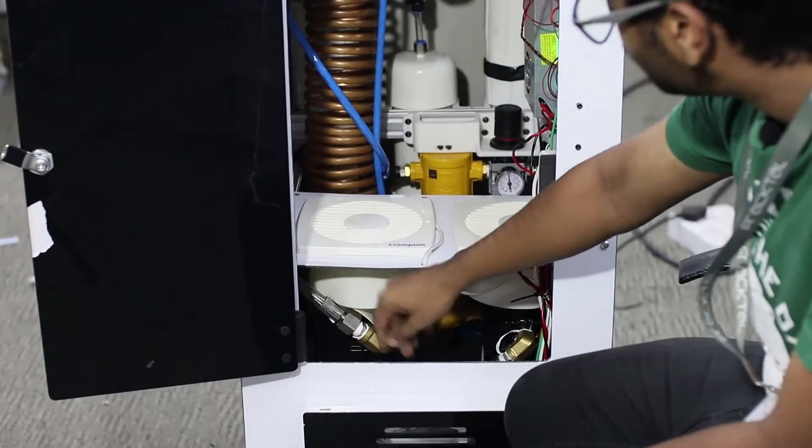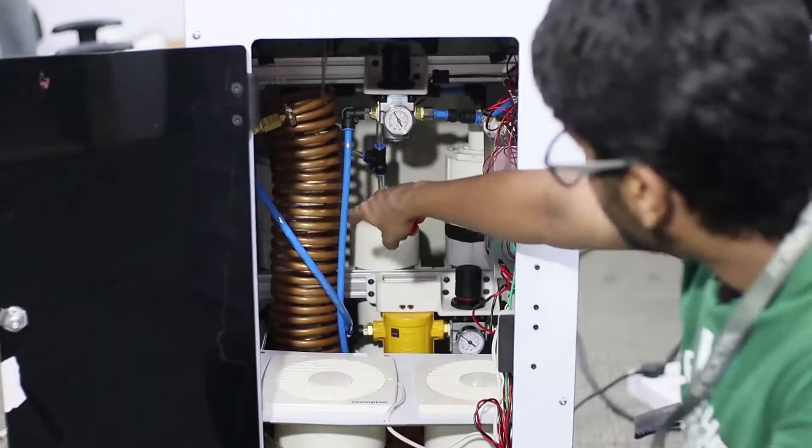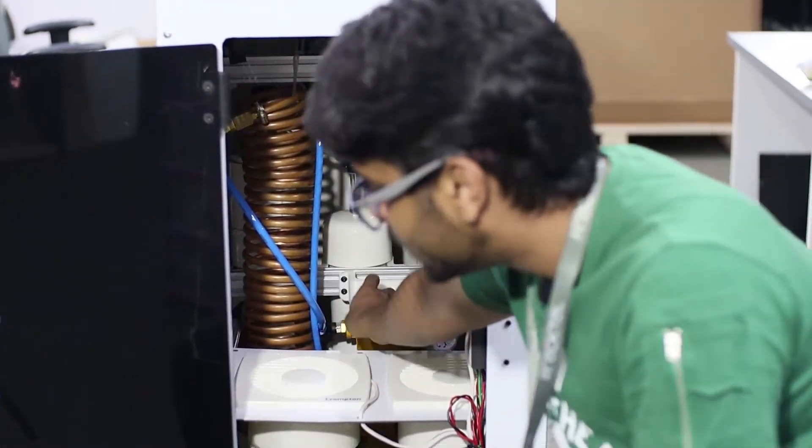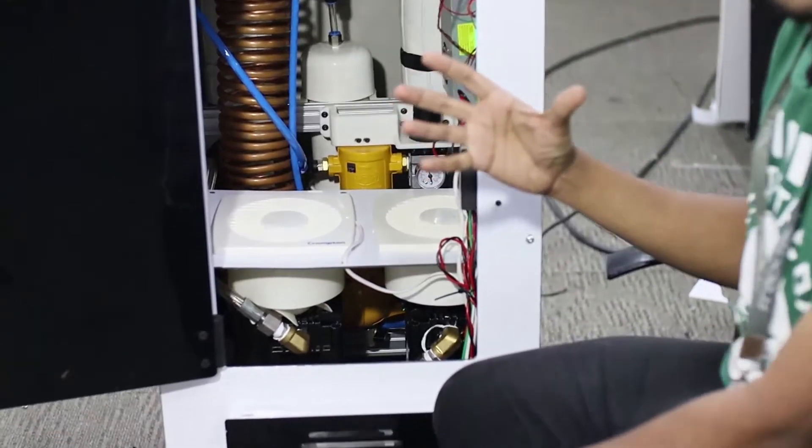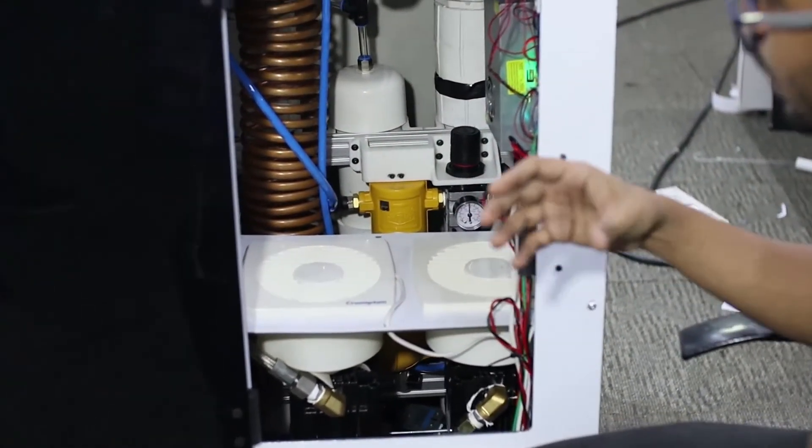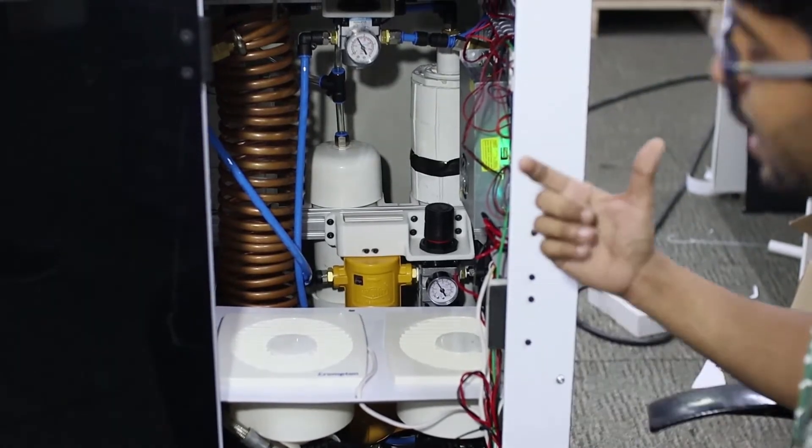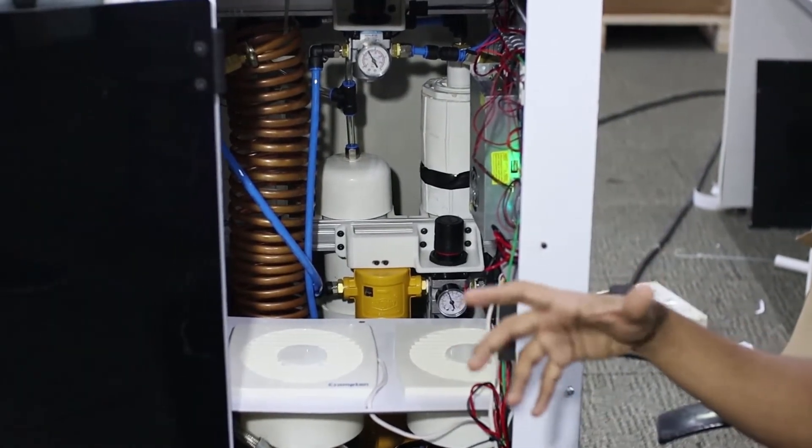The air from the compressor is cooled with the copper cooling coils over here. The cooling coils then go to a moisture separator. Now the moisture separator is a critical component because it removes all the water from the air. This is one of the critical components that are missing in most commercial oxygen concentrators, and that's the reason why most of them fail after a few weeks.